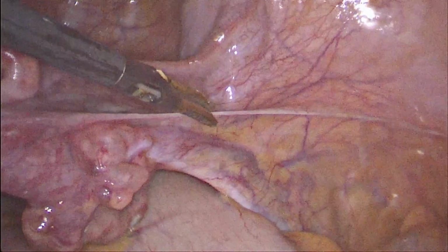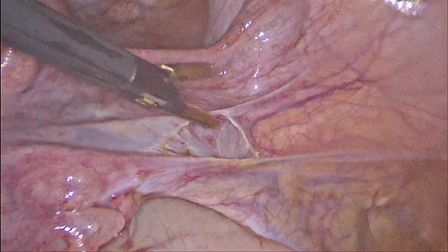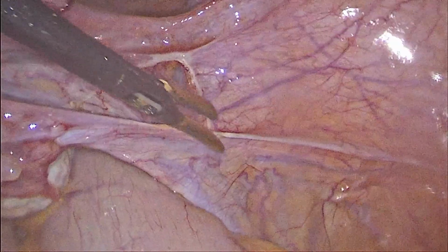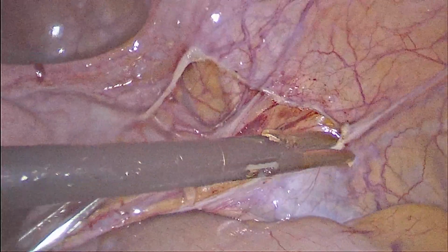To expose the uterine artery, a fold of peritoneum between the round ligament and infundibulopelvic ligament is opened to enter the pararectal space, that is, the lateral pararectal space.